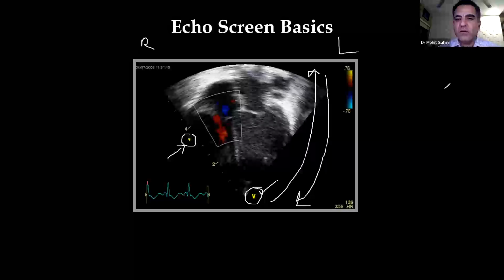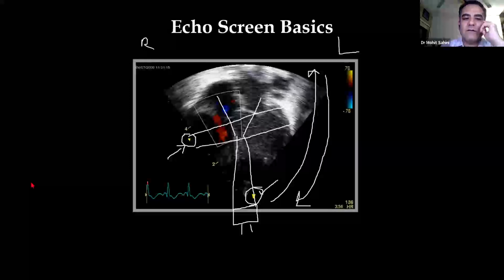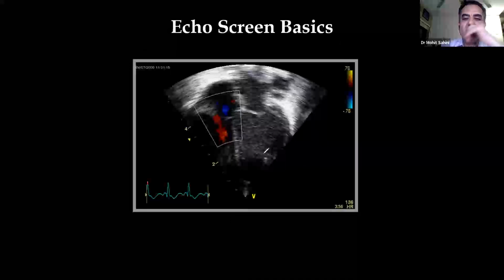With focus, if you adjust the focus in this particular area, what will happen? The ultrasonic waves, which are being seen here from the probe, because the probe orientation marker is here, will get concentrated in that particular area, and then after that they will diverge. So this area where the focus is being placed will be more clear and the resolution will be better in that area. So that is regarding your probe orientation marker, sector, focus.